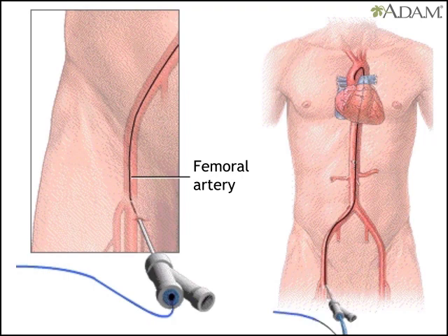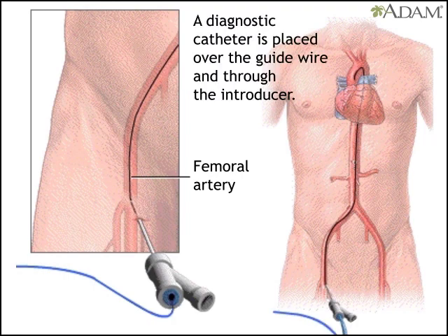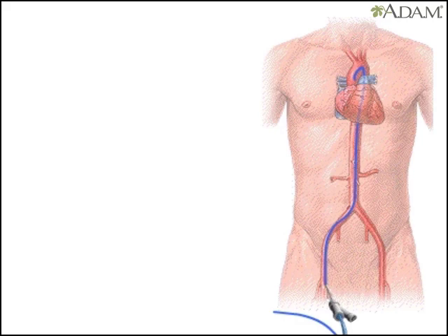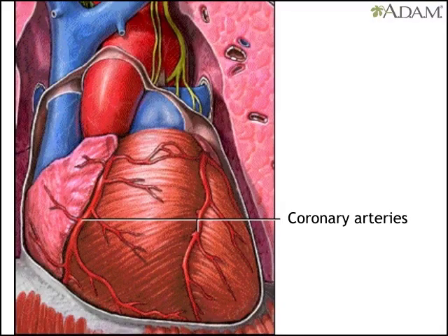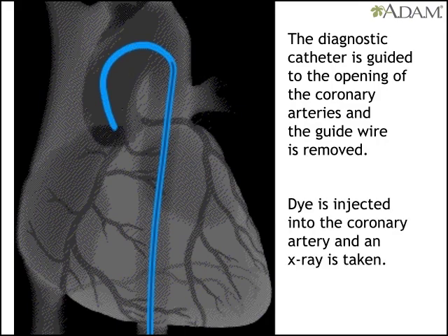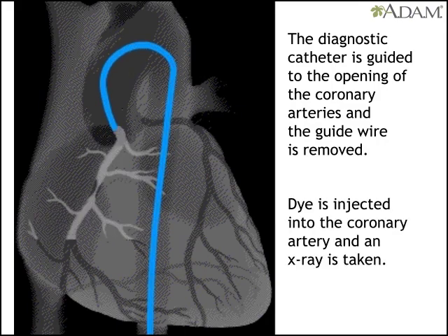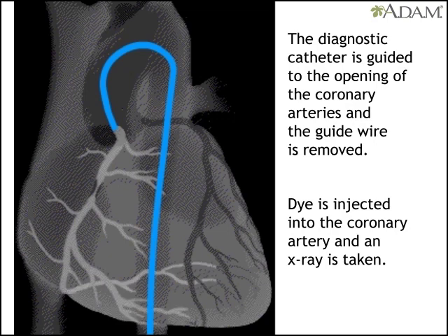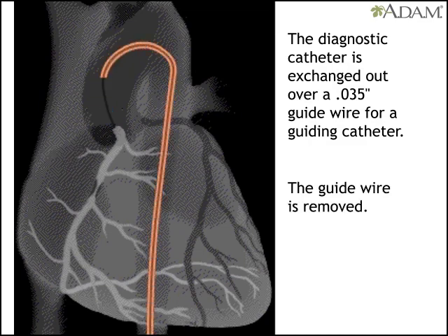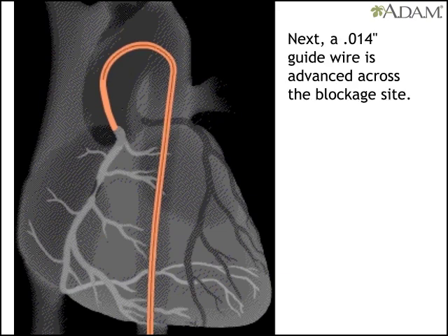Once the introducer is in place, the original guide wire is replaced by a finer wire. This new wire is used to insert a diagnostic catheter, a long, flexible tube, into the artery and guide it to the heart. The doctor then removes the second wire. With the catheter at the opening of one of the coronary arteries, the doctor injects dye and takes an x-ray. If it shows a treatable blockage, the doctor uses another guide wire to remove the first catheter and replace it with a guiding catheter. Then the wire is removed and replaced by a finer wire that is advanced across the blockage.